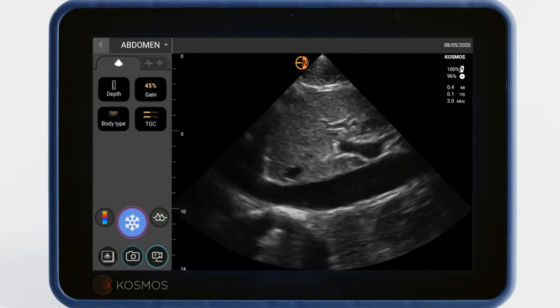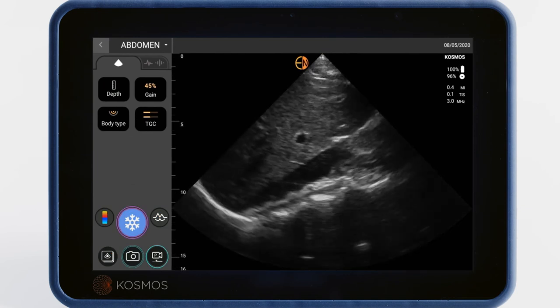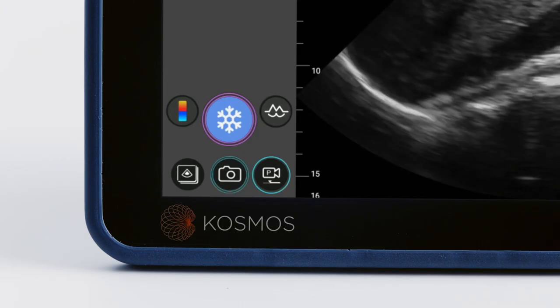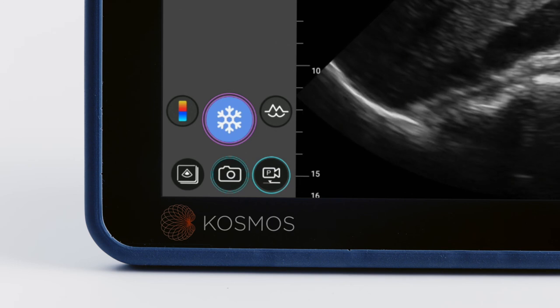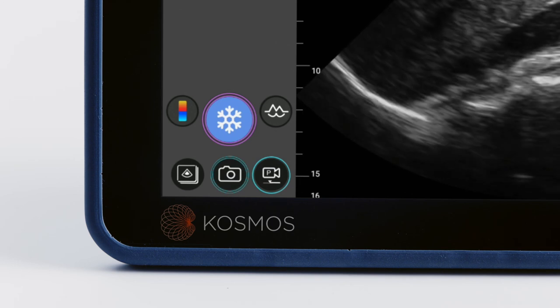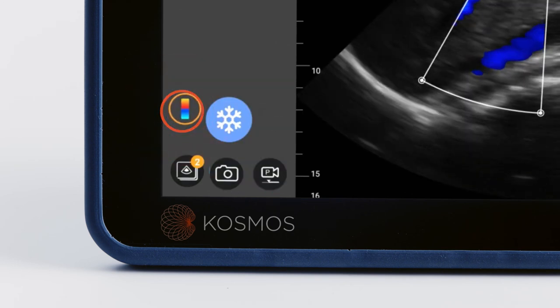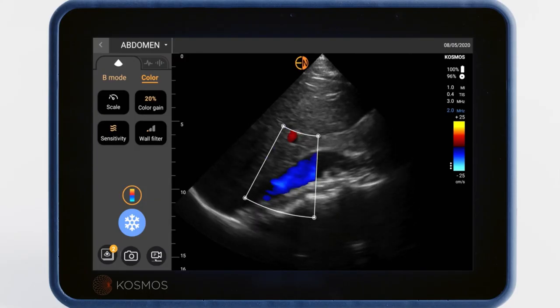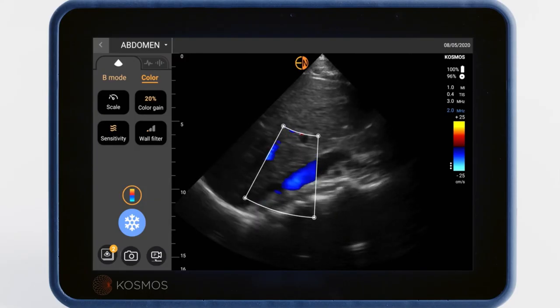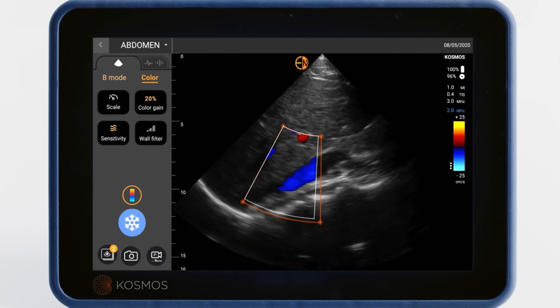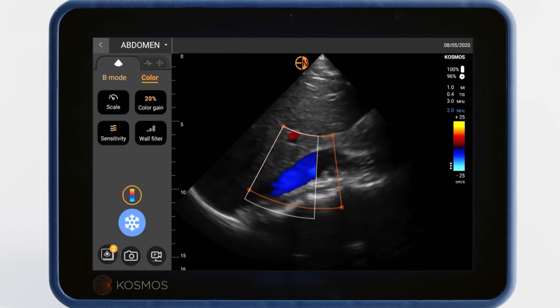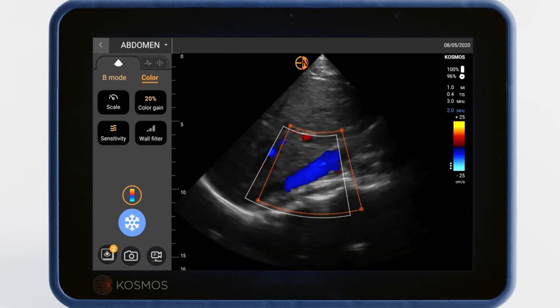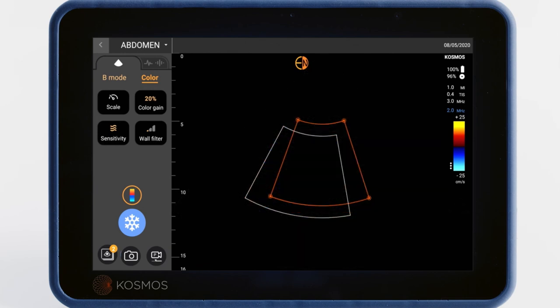Color Doppler is used to see the direction and velocity of blood flow. It can be turned on by tapping the color icon. The corners of the color box can be adjusted to resize it, and you can also drag the box into any position you'd like.